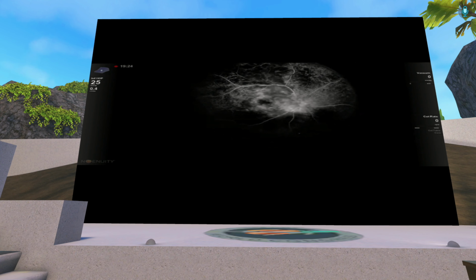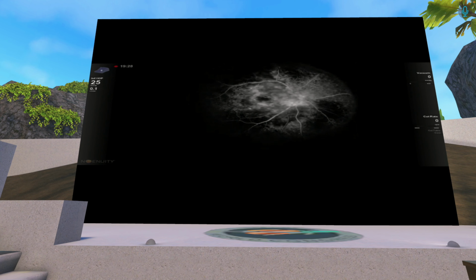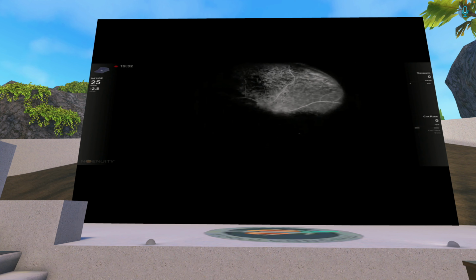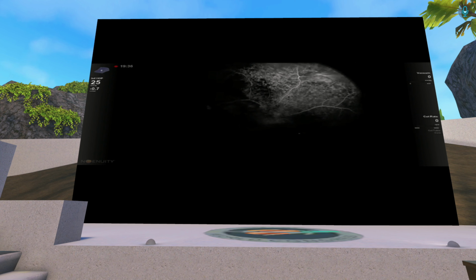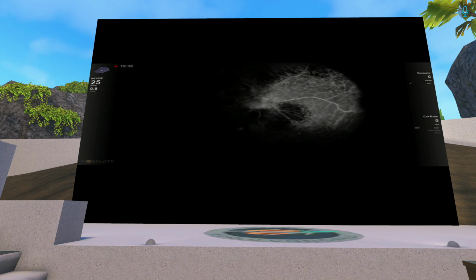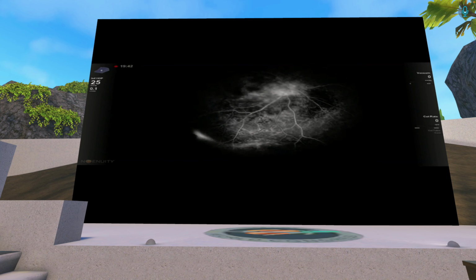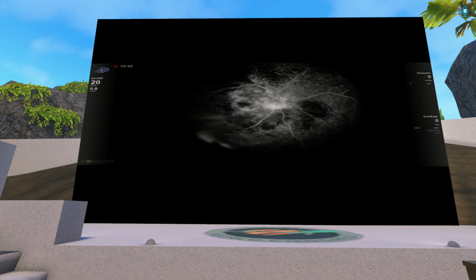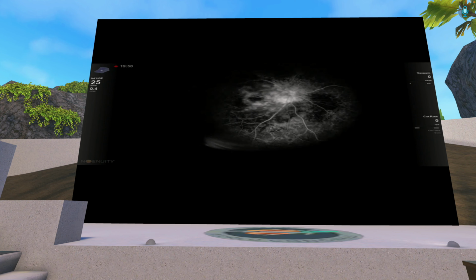I have a few light sources and they are multi-wavelength capable, but they are all xenon based. For example, this image here is not achieved with the constellation light source, the one that we are seeing at the moment, but the intraoperative guided endolaser with the chandelier was achieved exactly with the modified constellation.